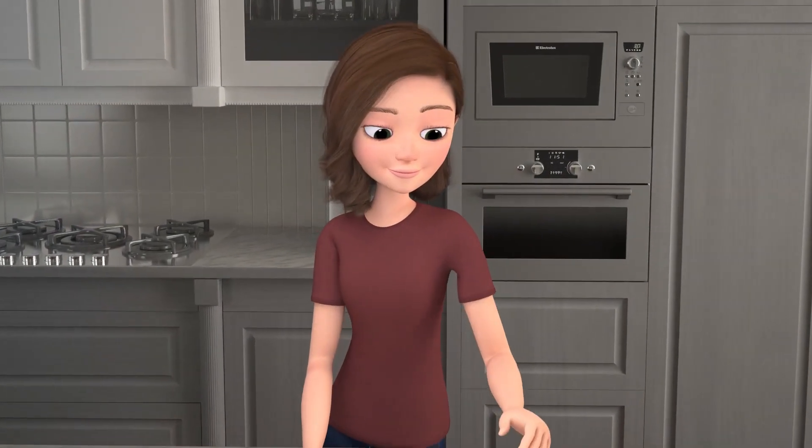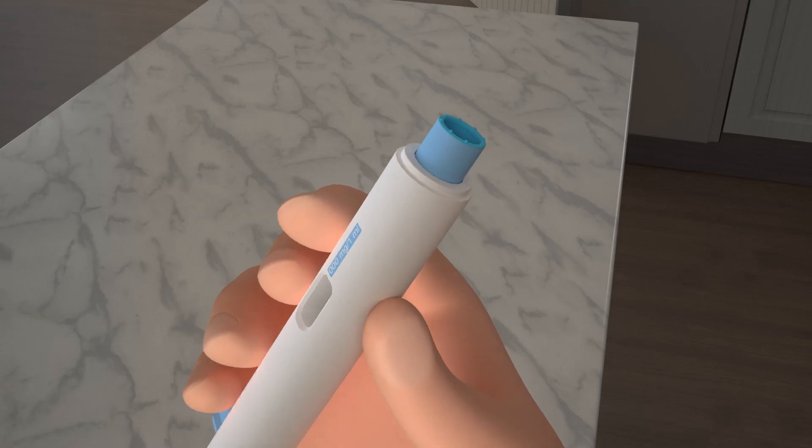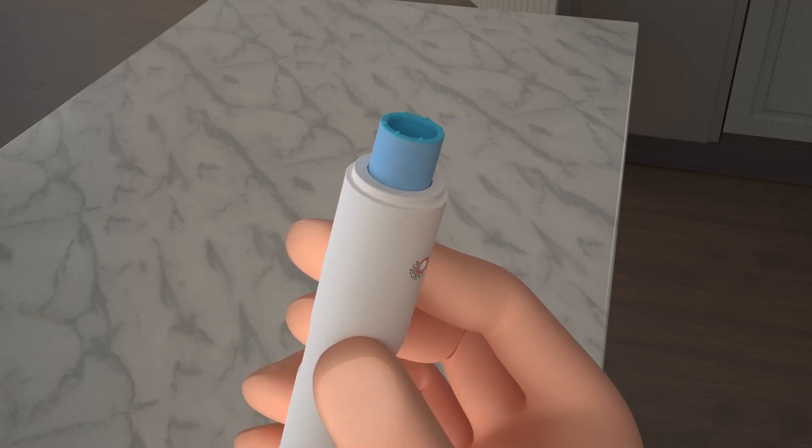Next, remove the UniPen cap and set it aside. The bumps at the bottom of the device are designed to decrease pain at the injection site.